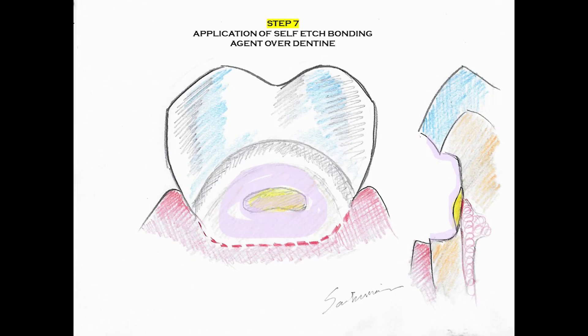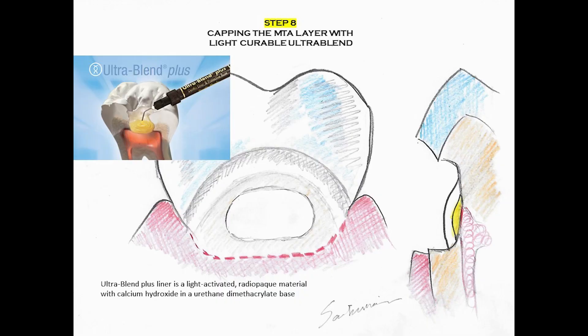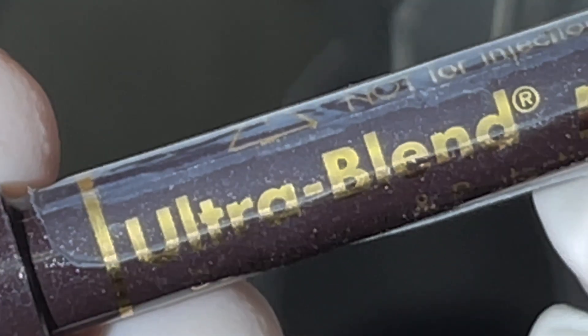We try to clean the peripheral excess of the MTA as much as we can, and we use a self-etched bonding agent to bond and coat the whole area of the dentin, trying not to directly touch the MTA, but rather having it just diffuse in from the side. We then gently dry it and cure and apply a layer of Ultra Blend.